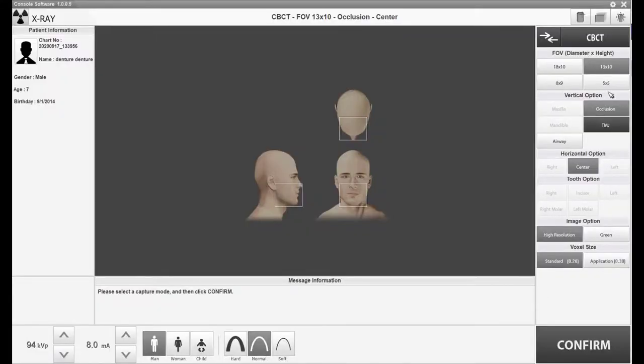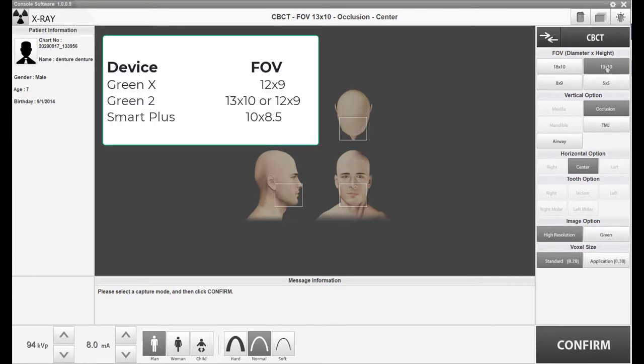From the Capture Console window, select the desired FOV. For Smart users, select 10x8.5. Green CT2 users select 12x9 or 13x10. Green X users will select 12x9.